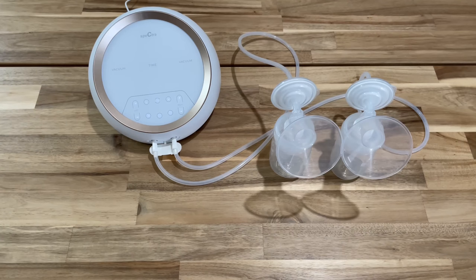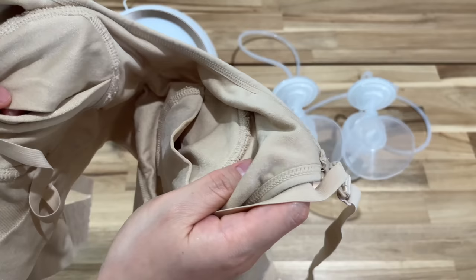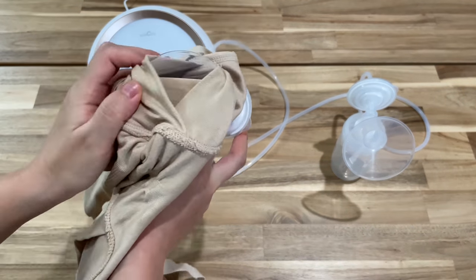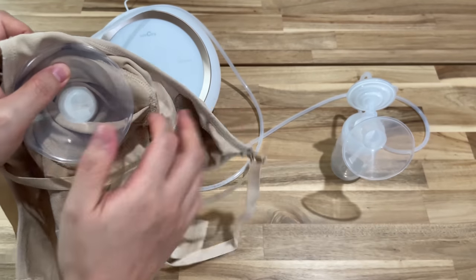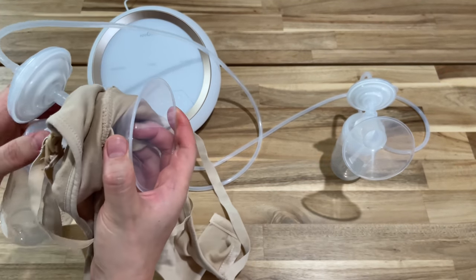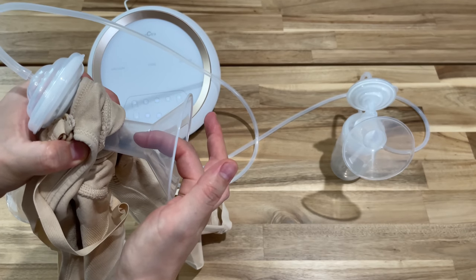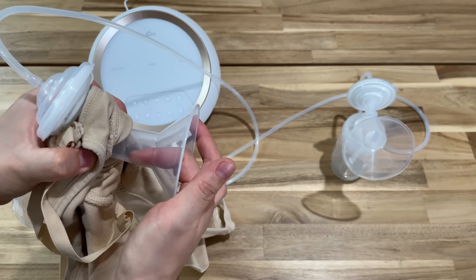To get started, I recommend using a pumping bra. This will help free up your hands to do something else. Insert the flange into the pumping bra and do the same for the other one. Once you put on your bra, make sure you center the flange to the nipple — the nipple needs to be centered onto the tunnel, because you don't want the nipple rubbing against the tunnel.